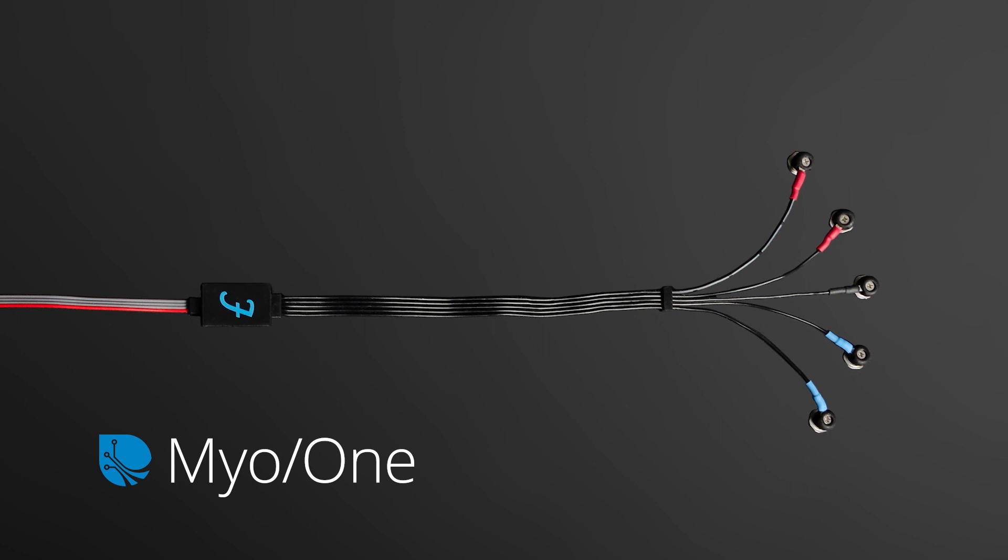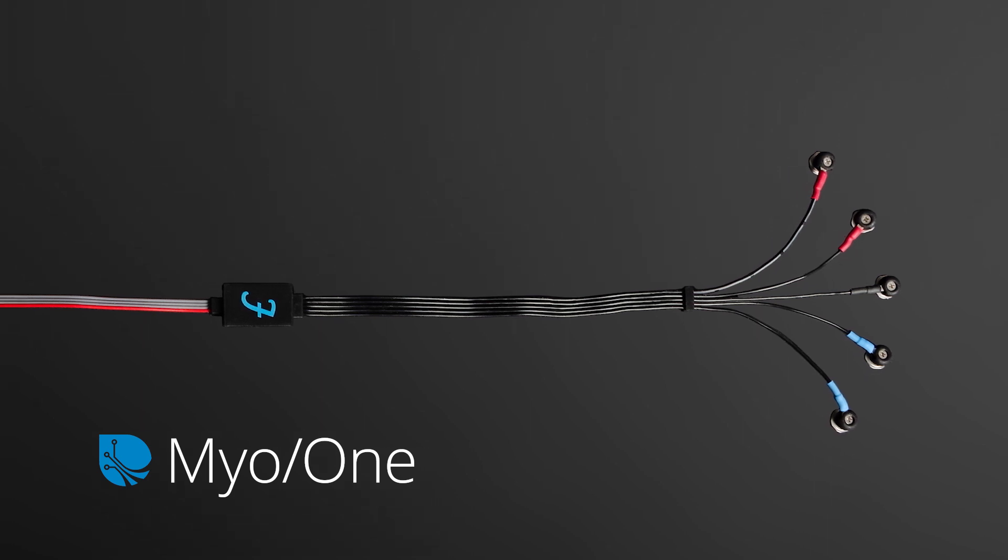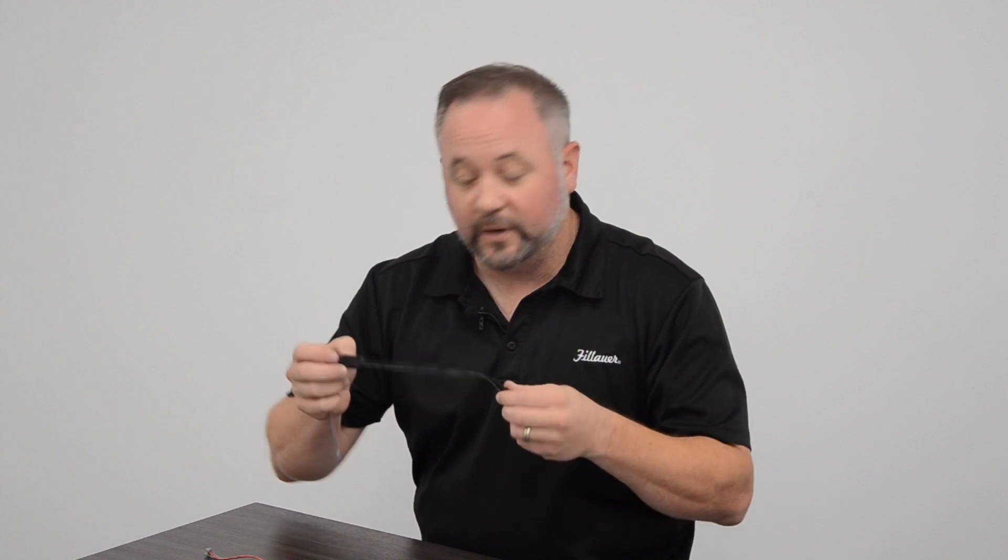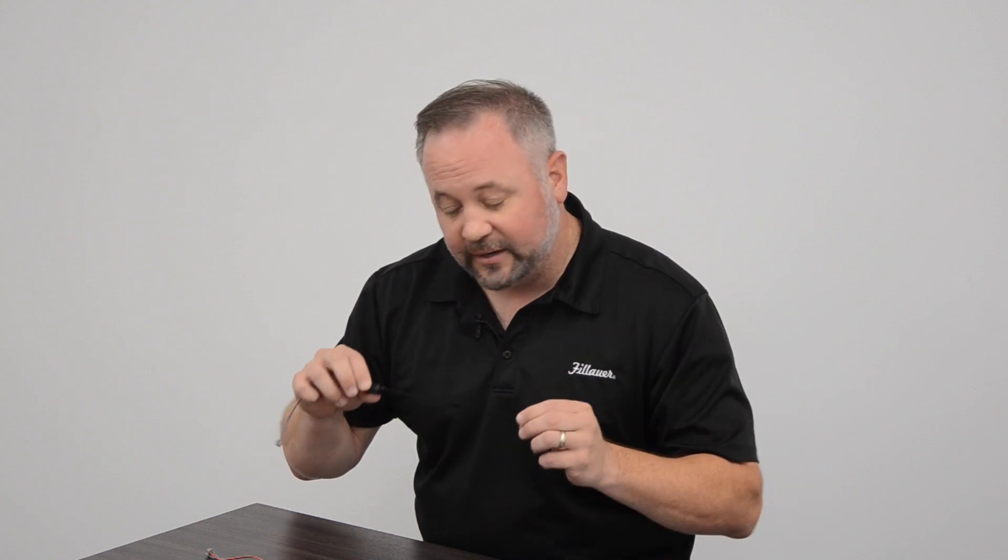Today I'm going to talk about the brand new product from Fillauer. This is the Myo/One Electrode. This was a partnership with Coapt to develop an electrode that solved a lot of the problems we have in trying to fit upper limb myoelectric patients.